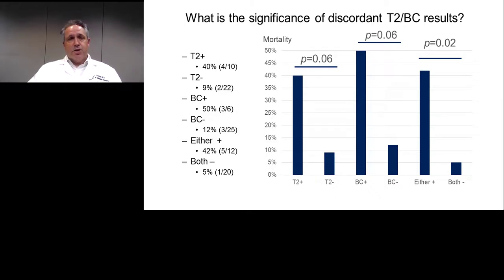So similar to the data out of Spain, our experience indicates that T2 positive, blood culture negative results do have clinical relevance and do identify a patient population that is more likely to have a bad outcome than in patients in whom both tests are negative.